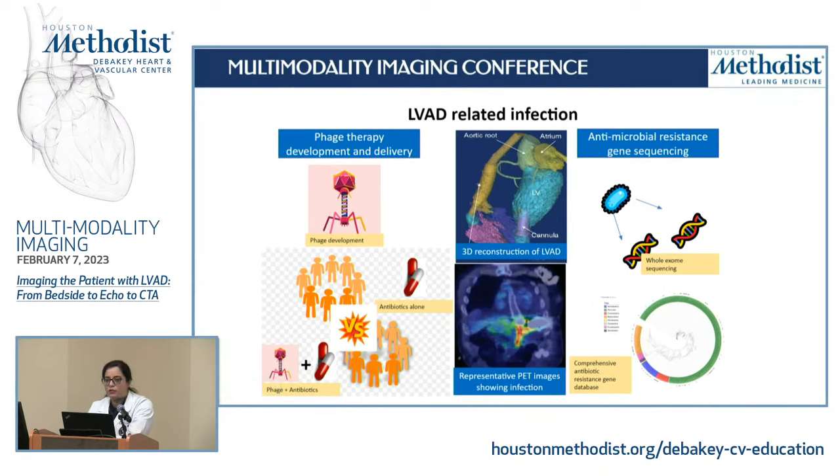PET is another test; we're ordering a lot of PET now to really quantify or understand the extent of the infections. We've seen infections at the outflow, inflow, all over the device. We are one of the few centers that do full exchanges for our patients, which means the whole device can be extracted and replaced, particularly in people who are on destination therapy. Remember, patients are living on LVADs for more than 5 years now. What is the end goal? The end goal could be a full exchange if the infection is severe.